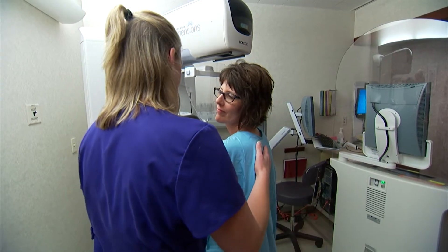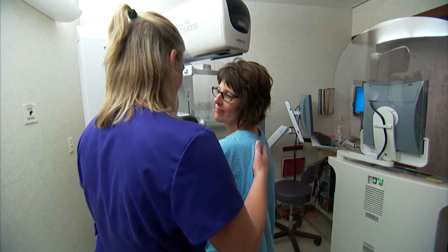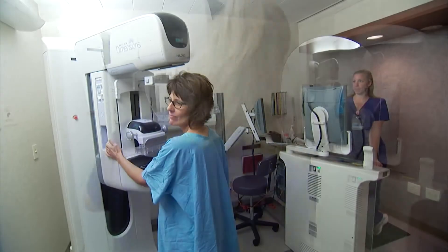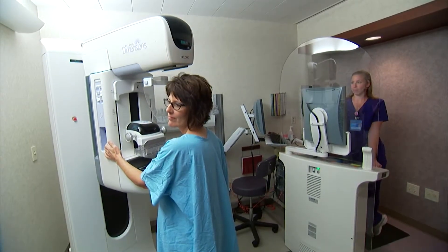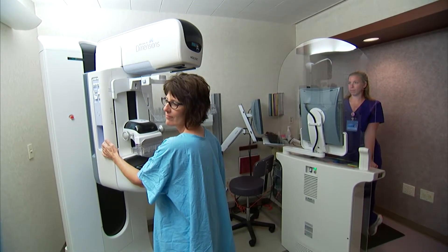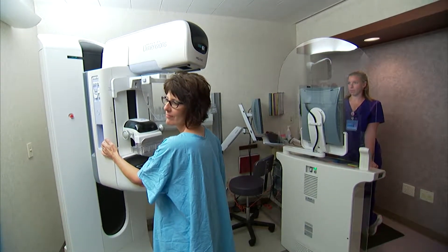Actually, for the patient, there's not much of a difference. She may only be in compression five additional seconds for the tomo image to be completed.